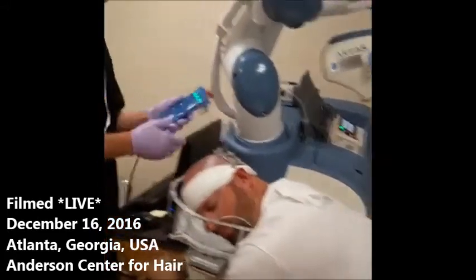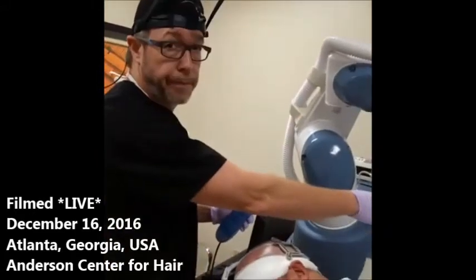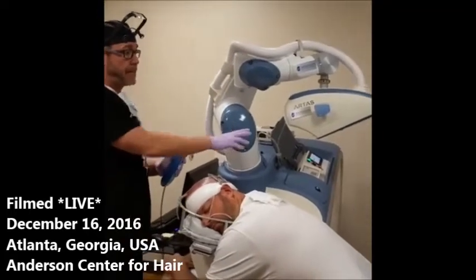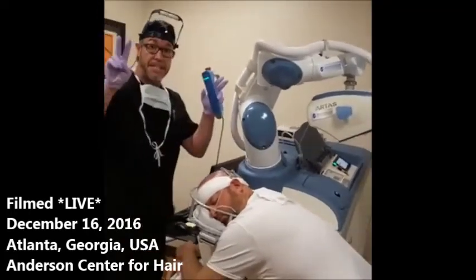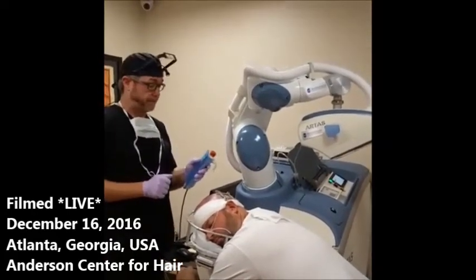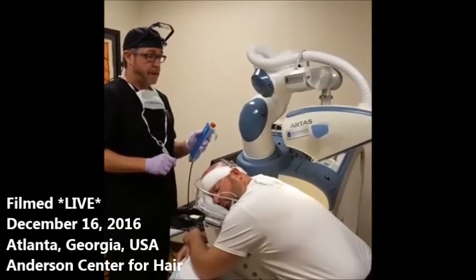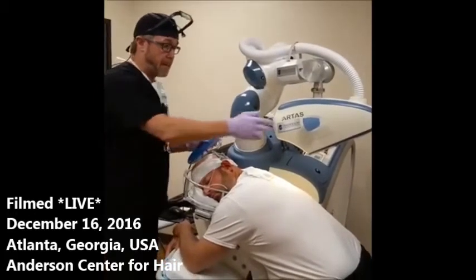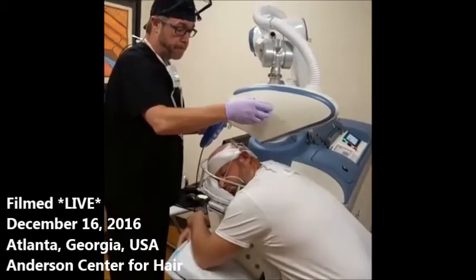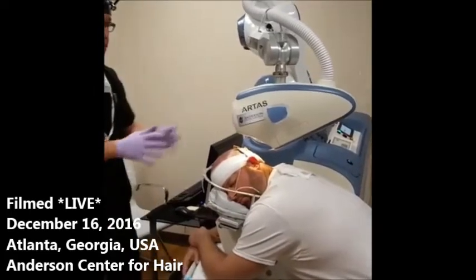What I'm going to do now is use the robot control fob, and we're going to bring in the six-jointed robotic head. It's got a couple of stereoscopic cameras inside that allow it to see, measure the angle, and identify the location of individual hair follicles. We're going to bring the robot head into position — this is called center position — and then I'll place it and press a button so it orients itself to the grid.